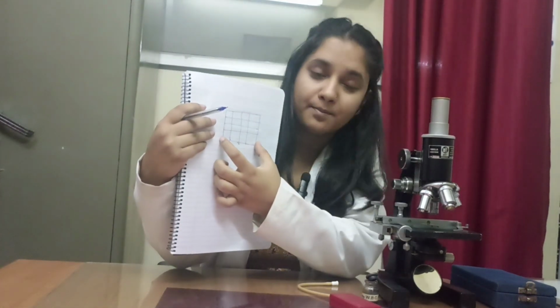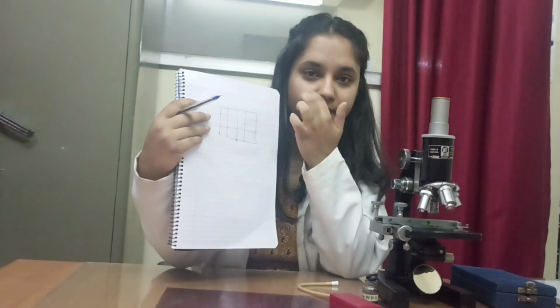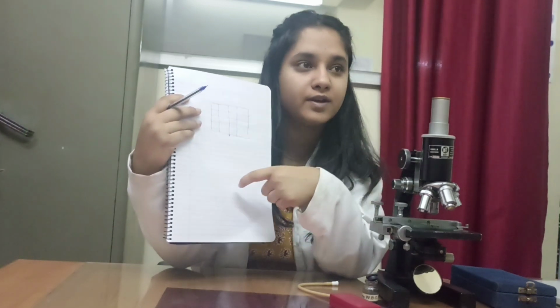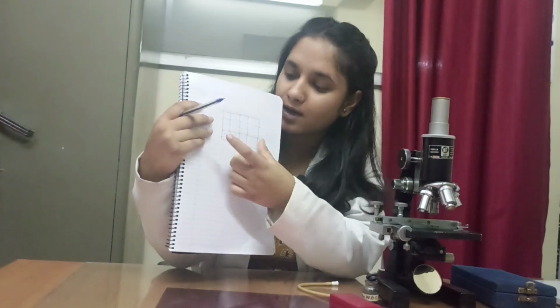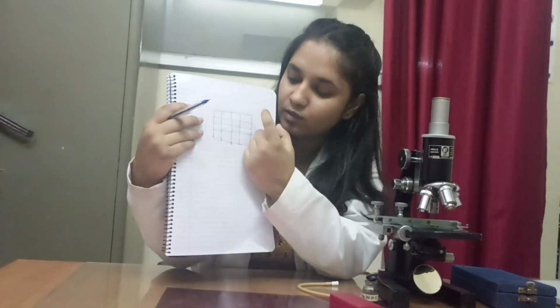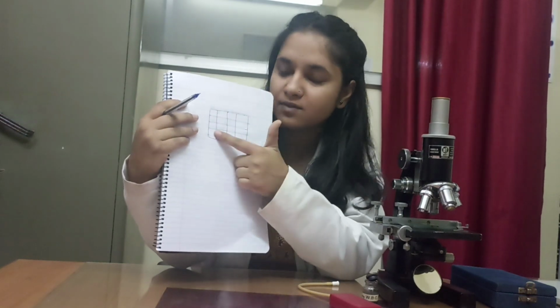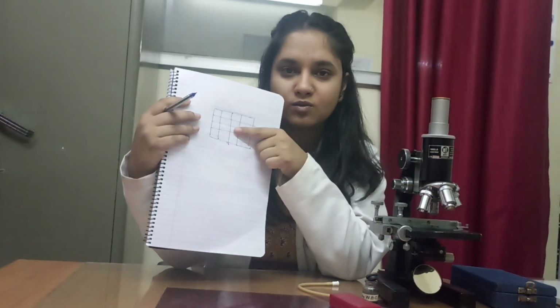This is one square of WBCs. Like this, four squares of WBCs are present. After counting one square, we should also count the second square, third square and fourth square in the same way. First, we have to calculate the first square. After that, this will be denoted as n.